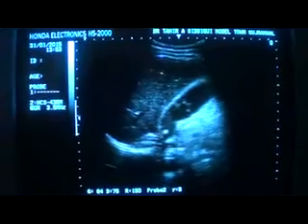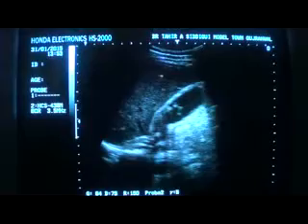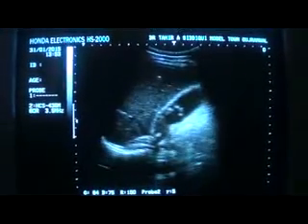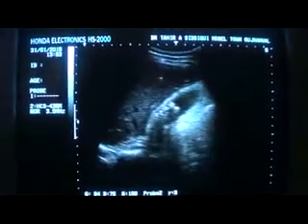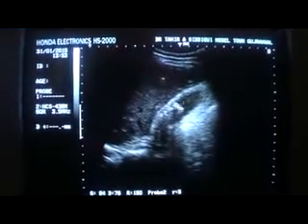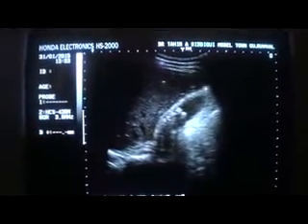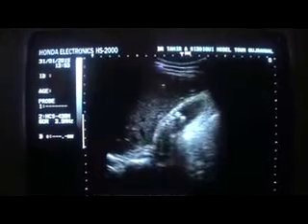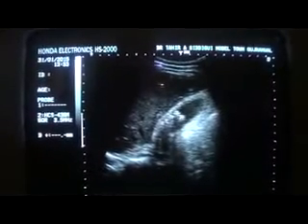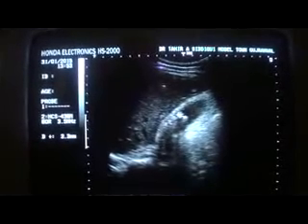What we are seeing here is that the picture in front of you is that of the gallbladder, and you are seeing tiny echogenic particles giving posterior shadow from this view. Now this is the fundus of the gallbladder. I'm sorry, I was seeing patients with uterus initially, so it slipped from my mouth. This is the gallbladder, and this is the fundus, and these tiny echogenic particles are consistent with gallbladder calculi.